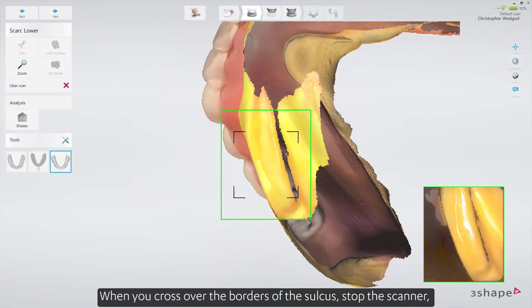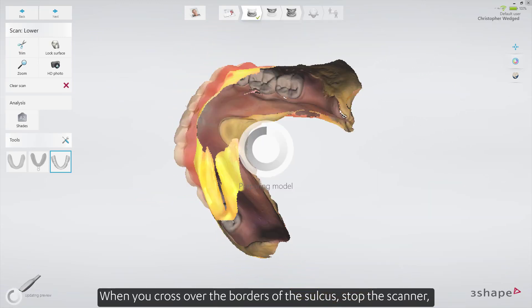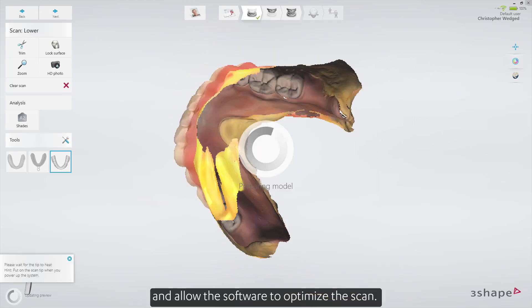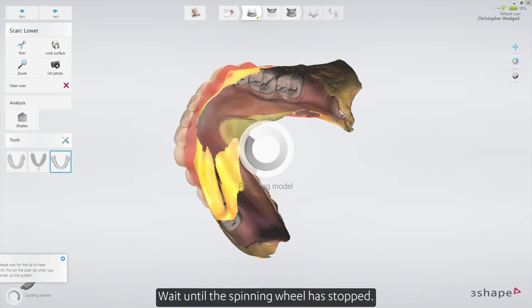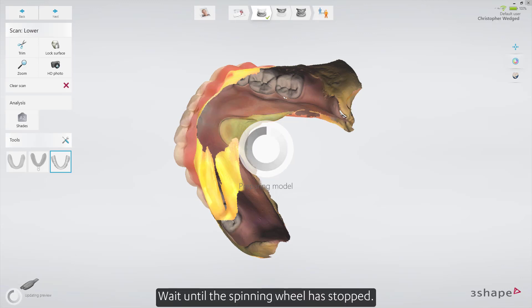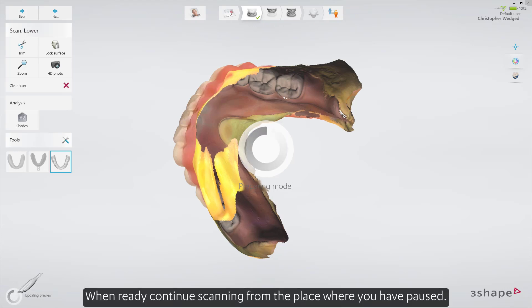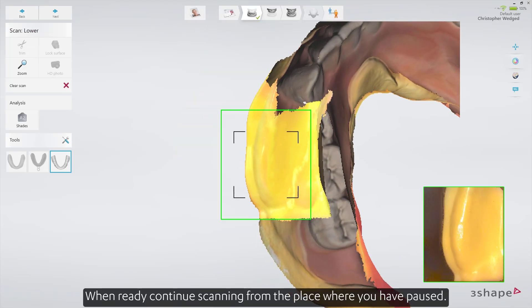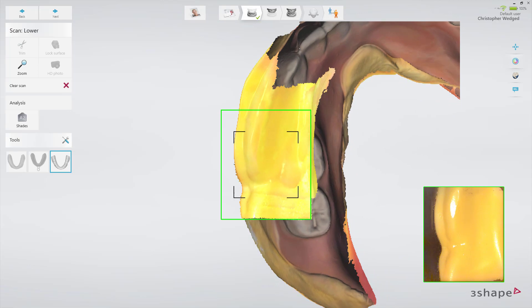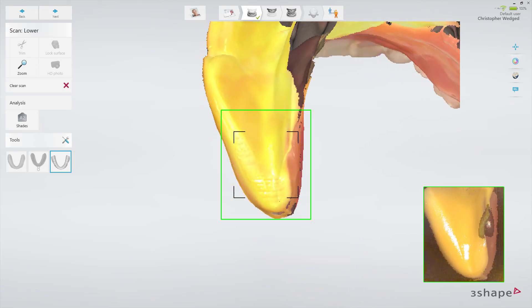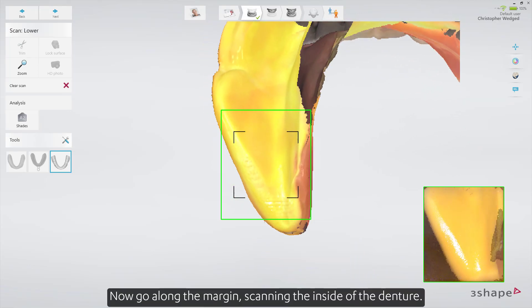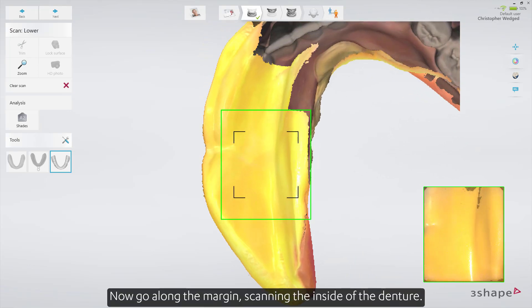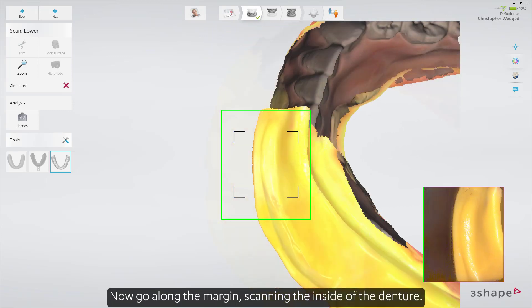When you cross over the borders of the sulcus, stop the scanner and allow the software to optimize the scan. Wait until the spinning wheel has stopped. When ready, continue scanning from the place where you paused. Now go along the margin, scanning the inside of the denture.